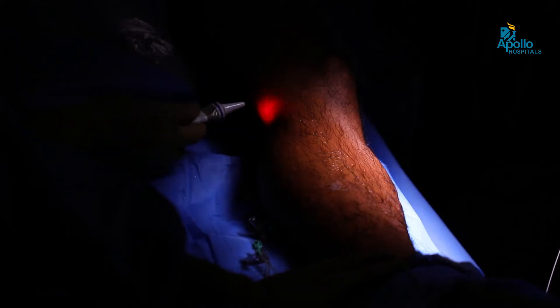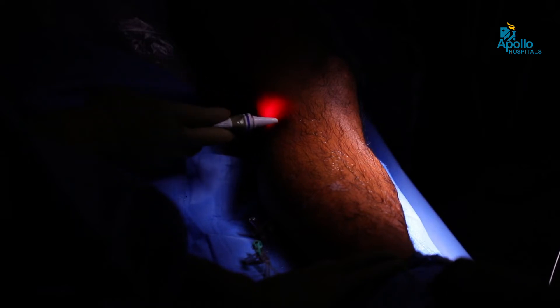Here you can see the laser fiber being pulled from the great saphenous vein from the saphenofemoral junction up to just below the knee joint. We don't burn the leg vein below the knee because saphenous nerve and sural nerve injuries are quite common below the knee. Below the knee we usually prefer only sclerotherapy or hook phlebectomies.